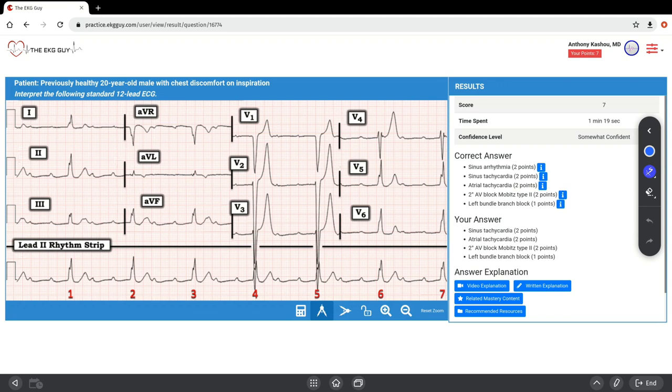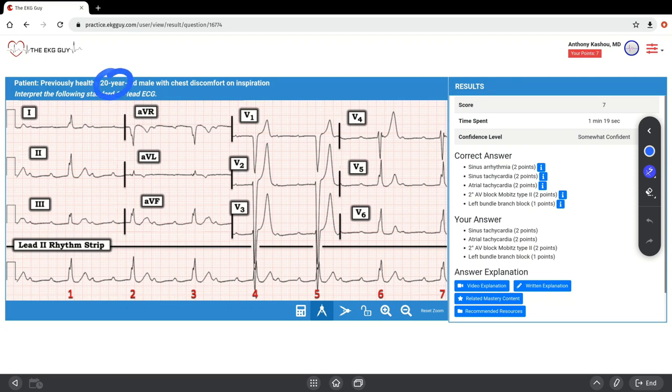Note that while the markedly deep anterior S waves that we saw in V2 and V3, these ones here, might suggest concomitant left ventricular hypertrophy, this is less specific in younger adults. Our patient here is 20 years old. For this reason, we've avoided the diagnosis of LVH.